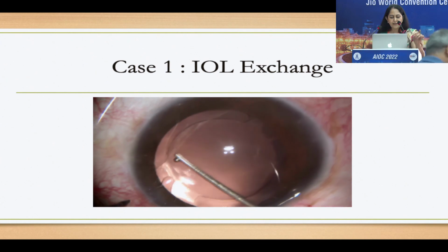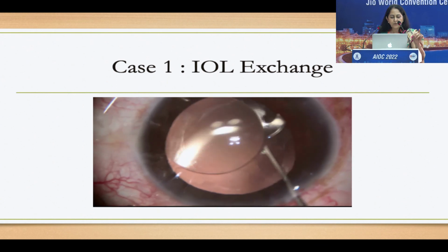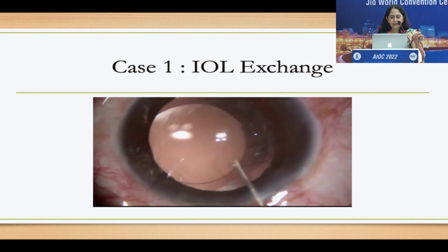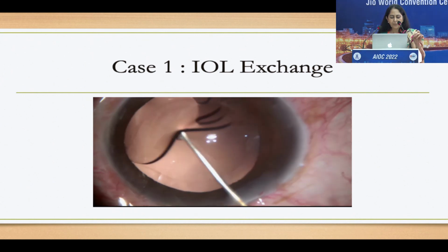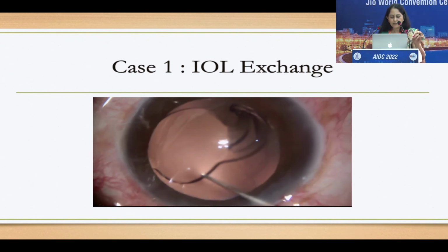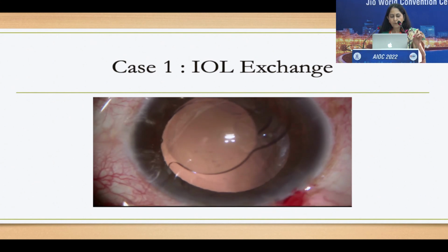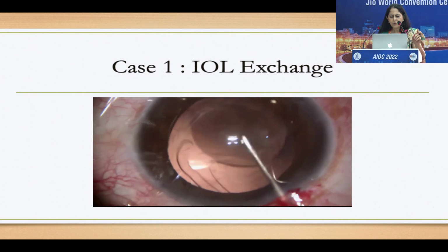If you see that the lens is moving without causing much force onto the zonules, again put in more viscoelastic and lift the lens to prolapse it into the anterior chamber very gently. First the first haptic, and then you need to put in more viscoelastic, lift it again gently and place the lens inside the anterior chamber, once over the anterior capsule. Once you've done that, you have to always be careful. It has to be very gentle maneuvering because you don't want any force on the zonules.